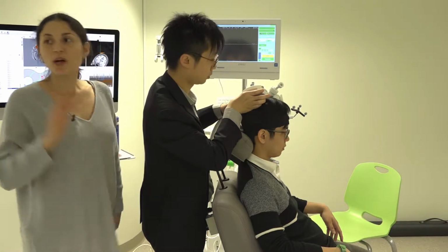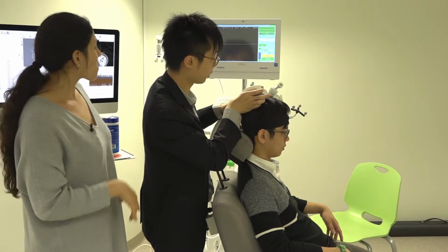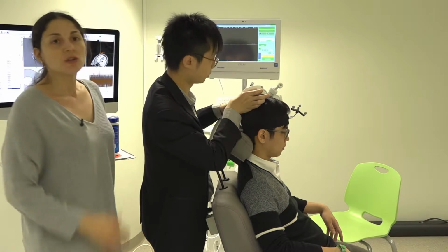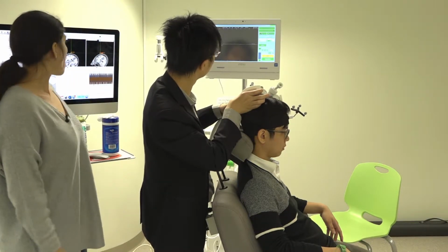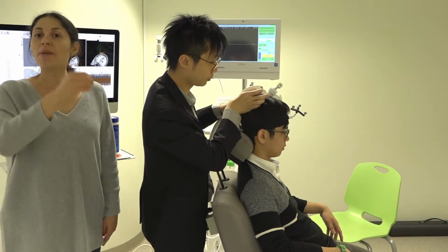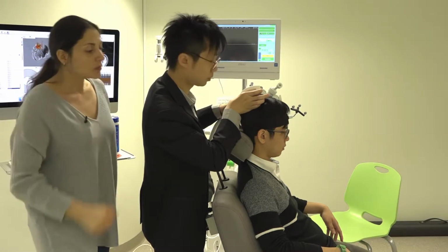So once you see a response, stay there. This is the area. It doesn't matter that you didn't get it this time. Stay there again. So somewhere here is the motor cortex, yeah? Now he can search from there for a better area where he can get a higher motor evoked potential.